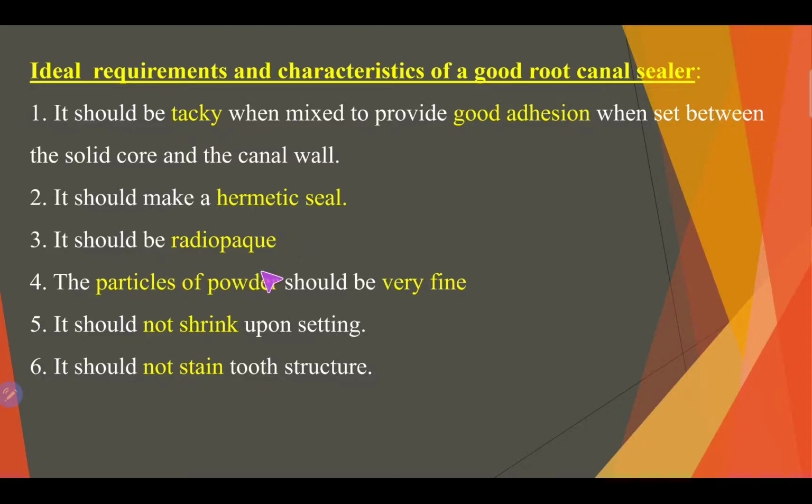It must be radiopaque to see it in the radiograph. Particles of powder should be very fine. This is a very important part. We said before that the sealers have two types, a paste type and a powder and liquid type.